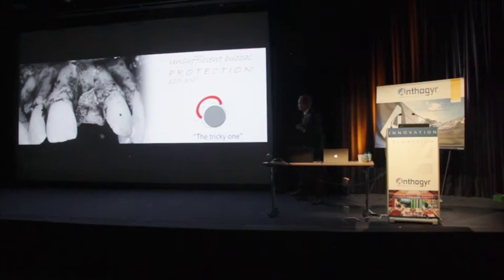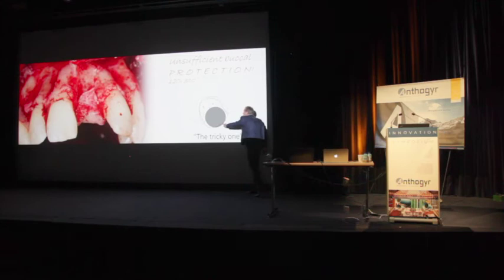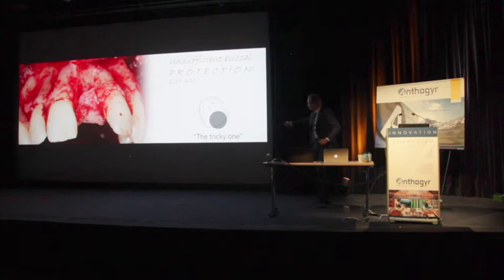You have this situation. So maybe better to place the implant more palatally and choose a smaller implant as well. And this is the difficult one. The cells cannot migrate fast enough buccally, because the bundle bone will disappear. You see that over here.